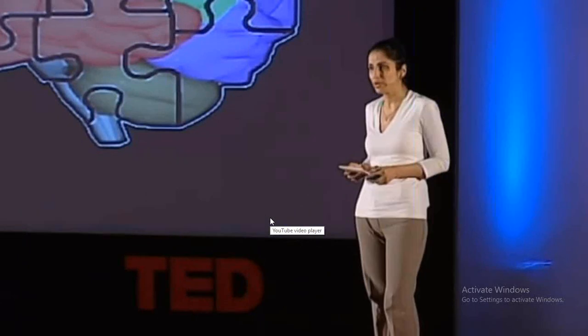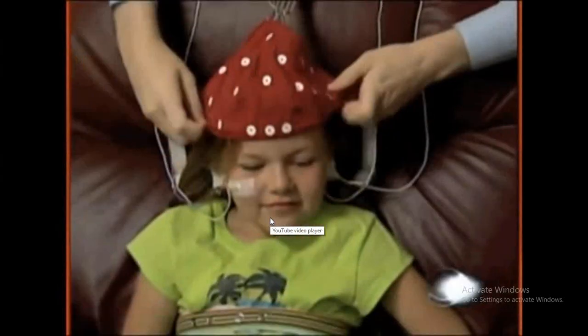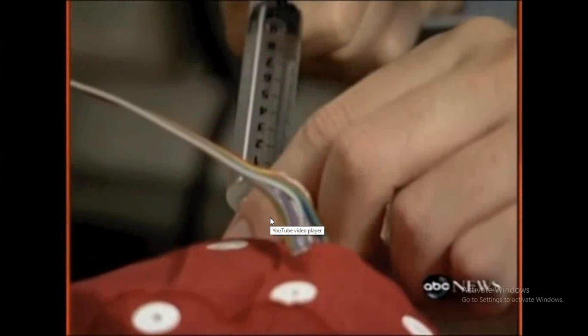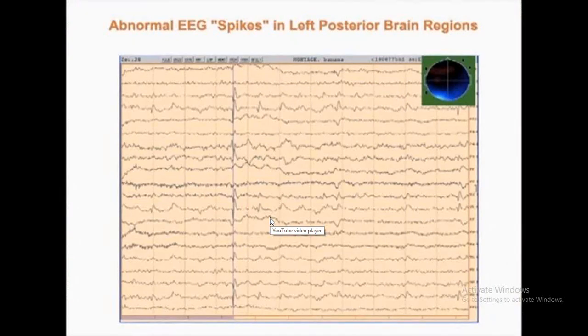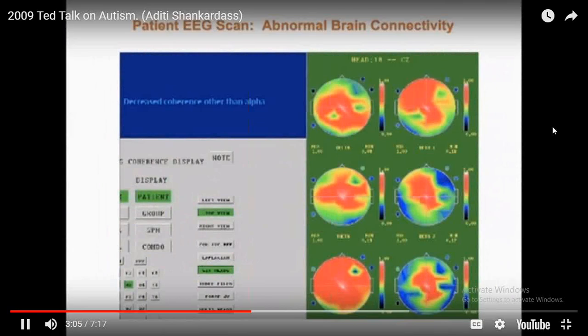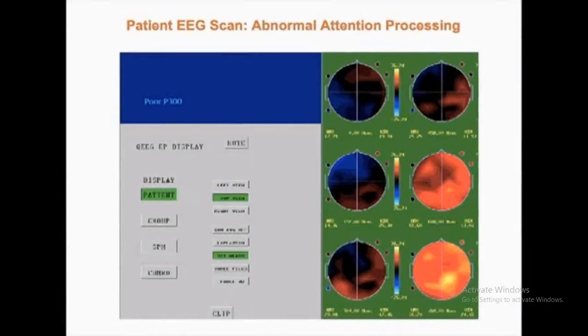And then I came across a team at Harvard University that had taken one such advanced medical technology and finally put it, instead of in brain research, towards diagnosing brain disorders in children. Their groundbreaking technology records the EEG, or the electrical activity of the brain, in real time, allowing us to watch the brain as it performs various functions and then detect even the slightest abnormality in any of these functions: vision, attention, language, audition. A program called Brain Electrical Activity Mapping then triangulates the source of that abnormality in the brain.